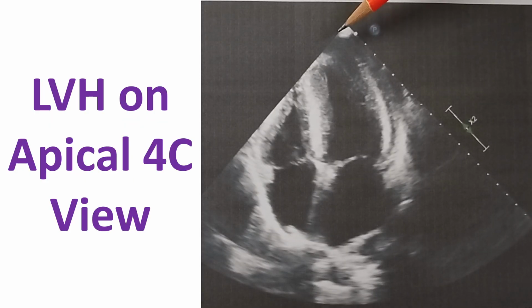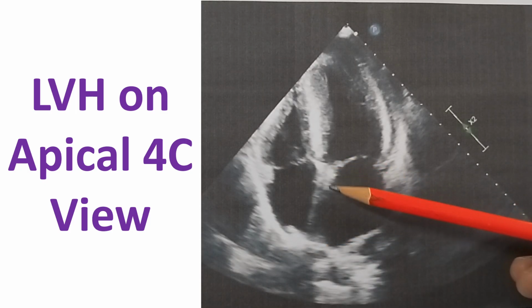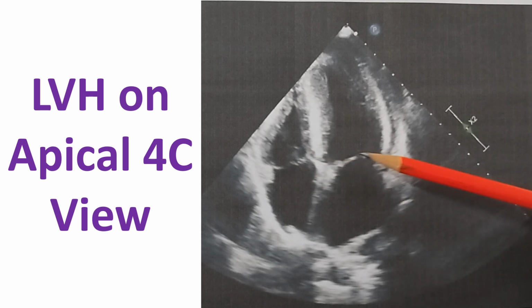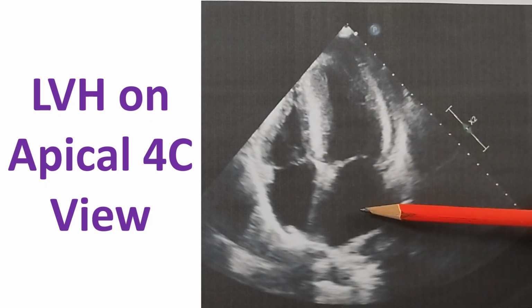Transducer is kept near the apex. Ideally, it should be exactly at the apex. You can see the thickened interventricular septum and free wall. This is the interatrial septum, atrioventricular junction. You can see the closed tricuspid valve, closed mitral valve, right ventricle, right atrium, left ventricle, left atrium.